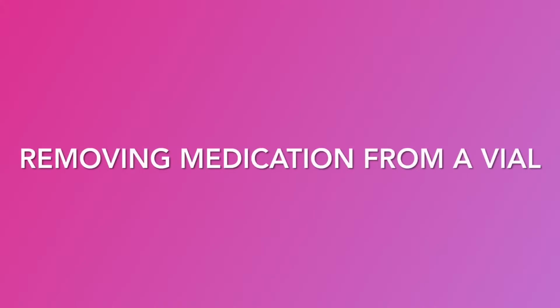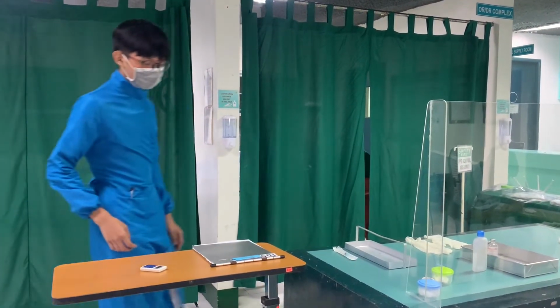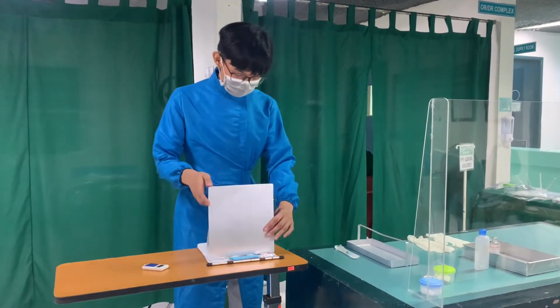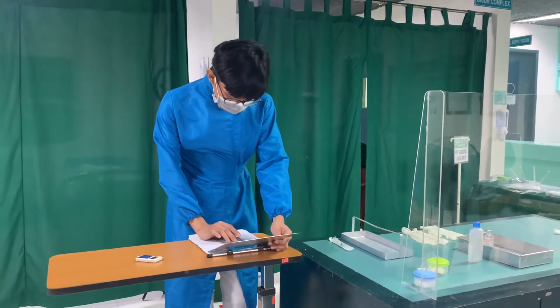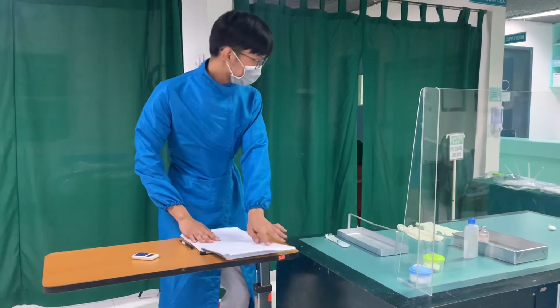Removing medication from a vial. The proper dosage of medication is withdrawn into a syringe using sterile technique. Gather equipment. Check the medication order against the original order in the medical record according to the facility policy.